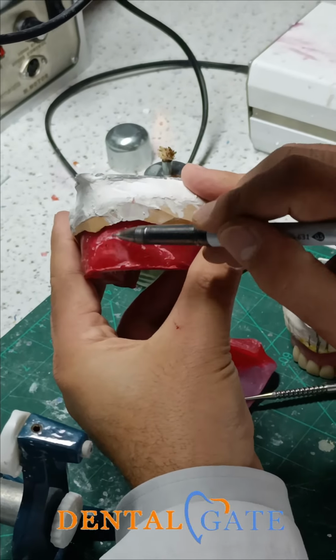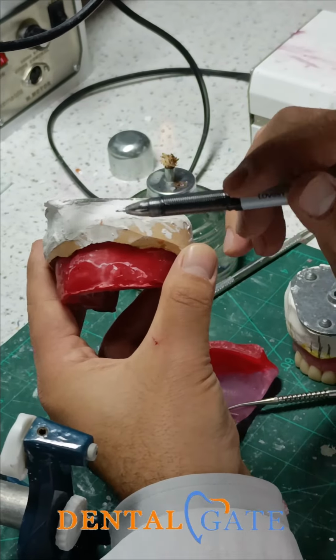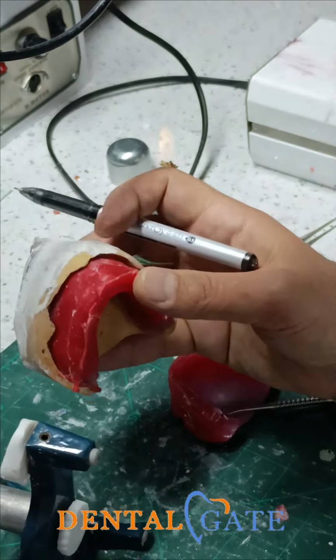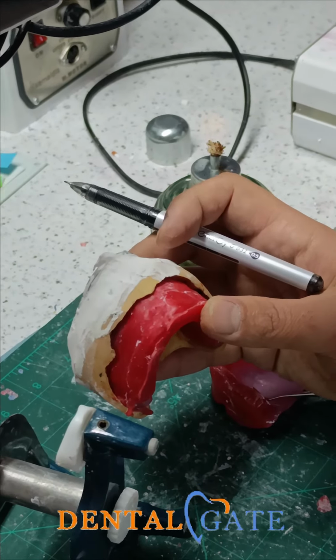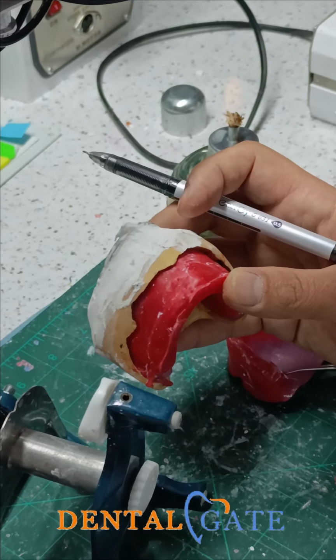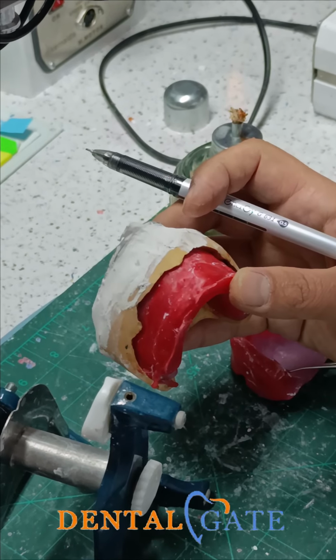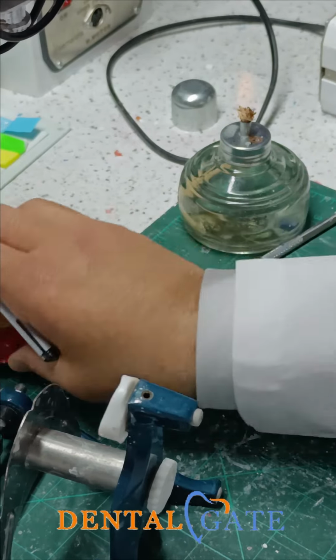It will stimulate this shape, okay? The central incisor should be inclined labially. So you can see I will depend on my bite rim within the arrangement because it will produce all the information and index that will be used in the teeth arrangement.